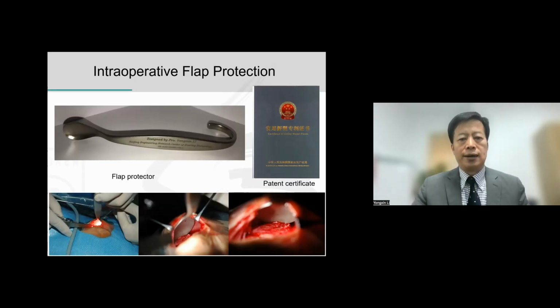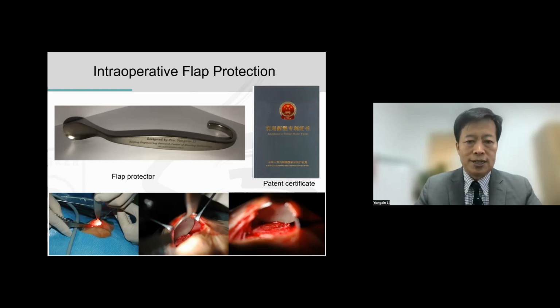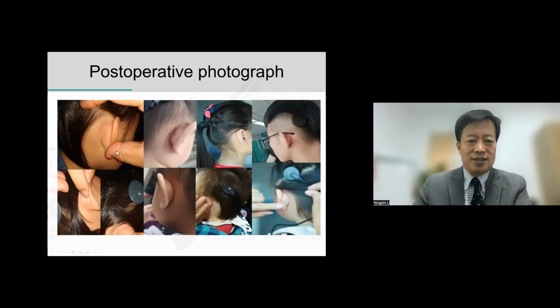Also in China, the parents prefer the small incision technique compared with a large incision technique. You can see it is not easy to find the incision post-surgery. All the cases were done with MED-EL devices. Very small incision technique, very good.